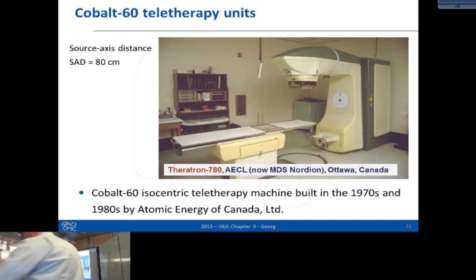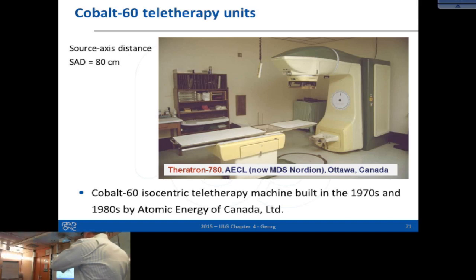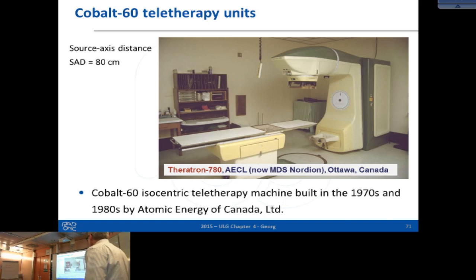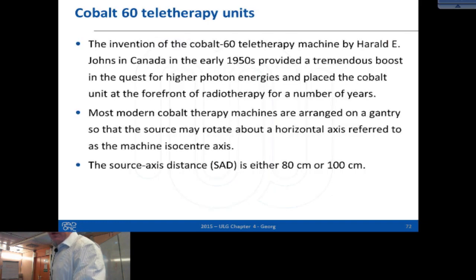Okay, now the last machine in external beam therapy is this famous cobalt unit. I've shown already some pictures. We had in our department a unit until the late 90s. From the mechanical design, it looks very similar to an accelerator. It has a C-arm, it has a rotational gantry, rotation table, and so on. Same treatment head with movable collimators, so a very simple and similar principle.